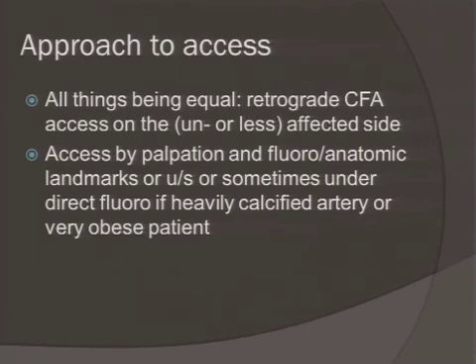All right, so routine for femoral artery access. How many people use fluoro to mark before you puncture? Probably almost everybody. Do you use fluoro to mark even if you're going to use ultrasound?